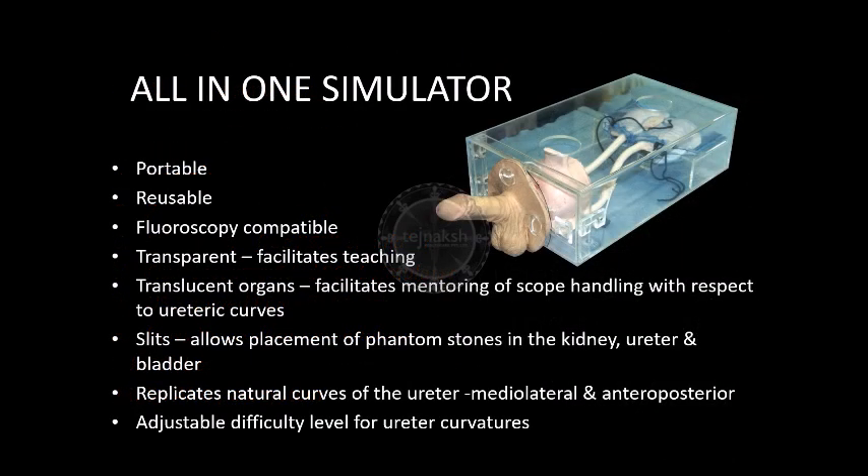The all-in-one simulator is light, portable, reusable, and fluoroscopy compatible. The transparent module allows the mentor to teach the anatomy and natural curves of the organs. During simulation, the translucent organs of the module allow the mentor to observe the scope position and trainees' movements for better training. The provided slits allow the placement of phantom stones in the kidney, ureter, and bladder, which allows practice of stone manipulation.